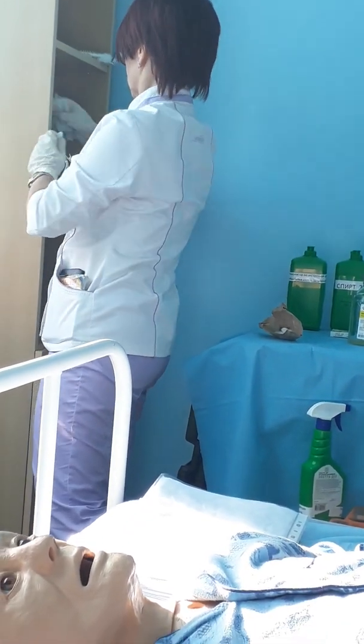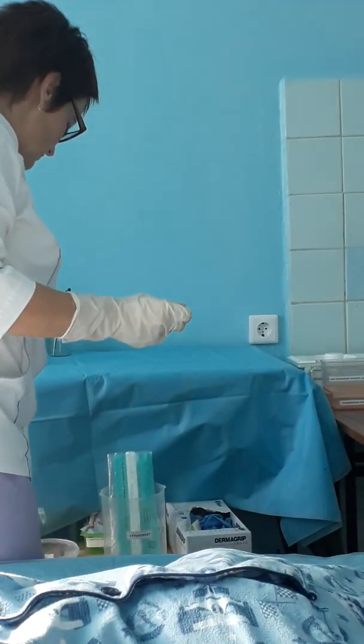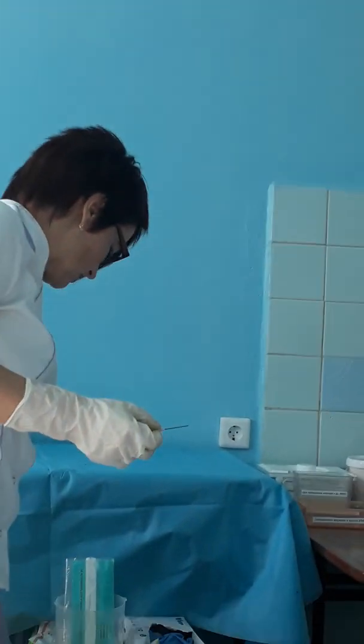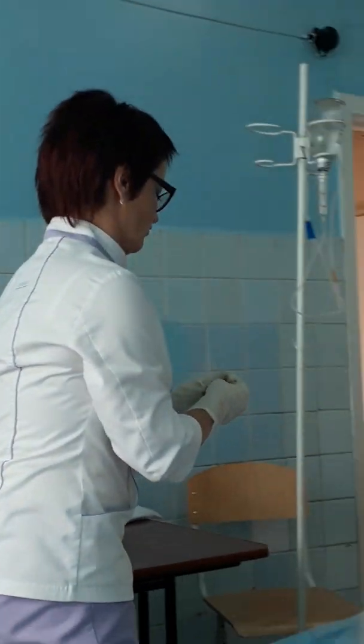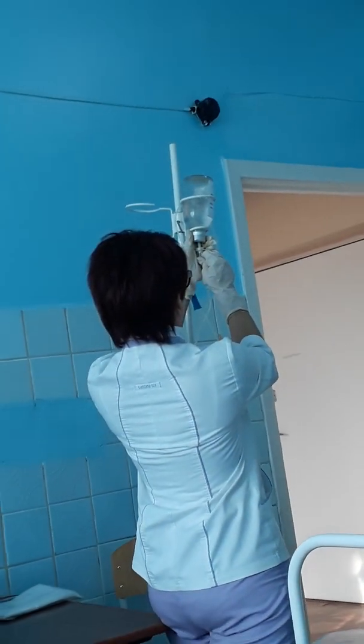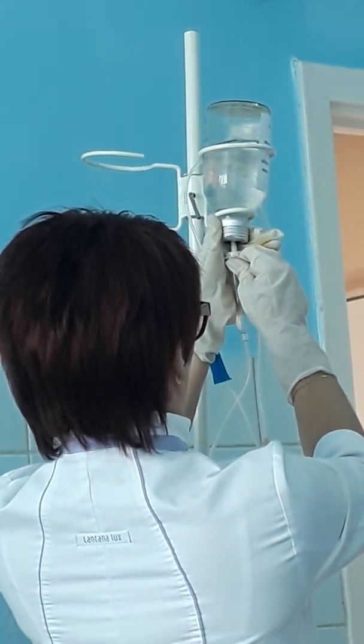And it's more convenient if you prepare a pink needle. This needle you can take in your hand, remove the cap, and perforate the rubber stopper near the needle for solution.